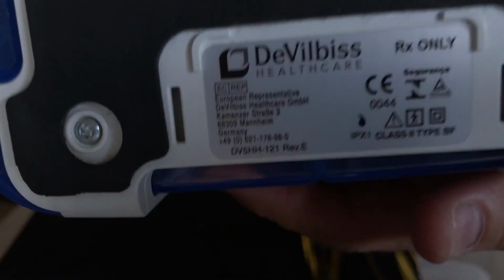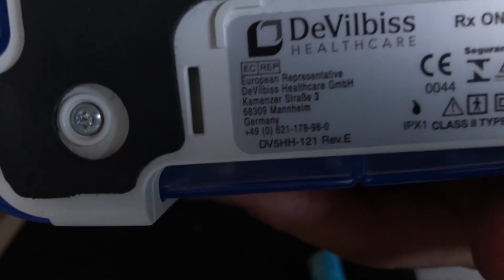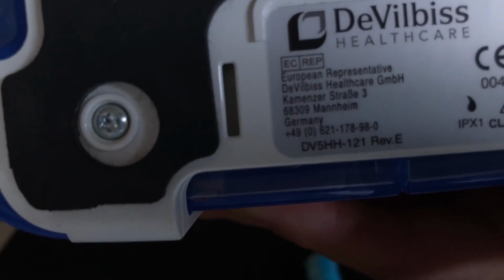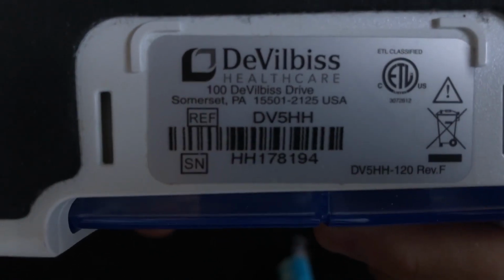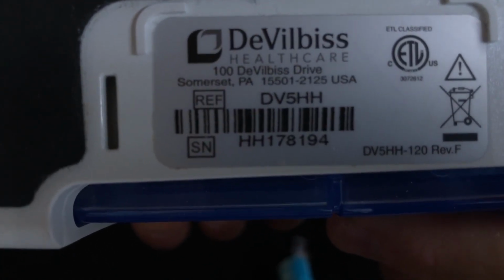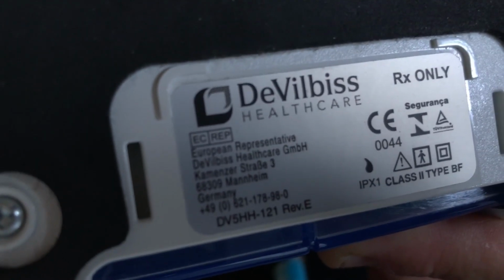That says DeVILBISS, and I believe it's, does it say when it's made? Not on that one. I think this one here should say anything. Serial number, nope. Should say somewhere here the date. I could have sworn I saw it before. No, okay, we'll have another look in a second, but let's open it up.